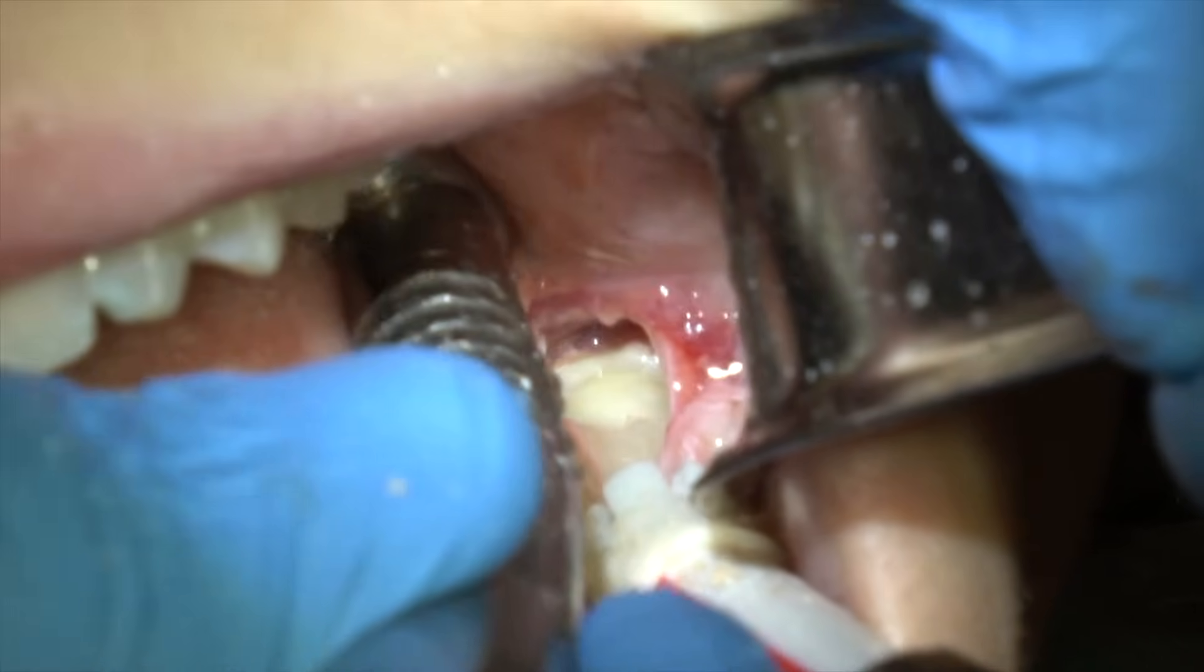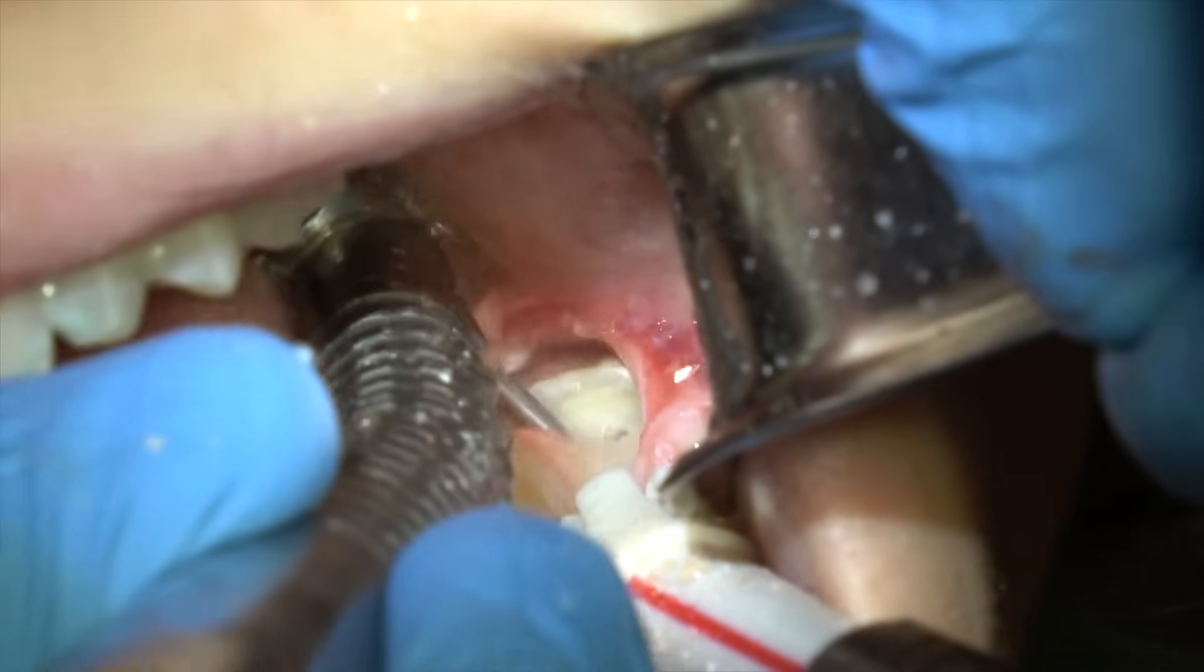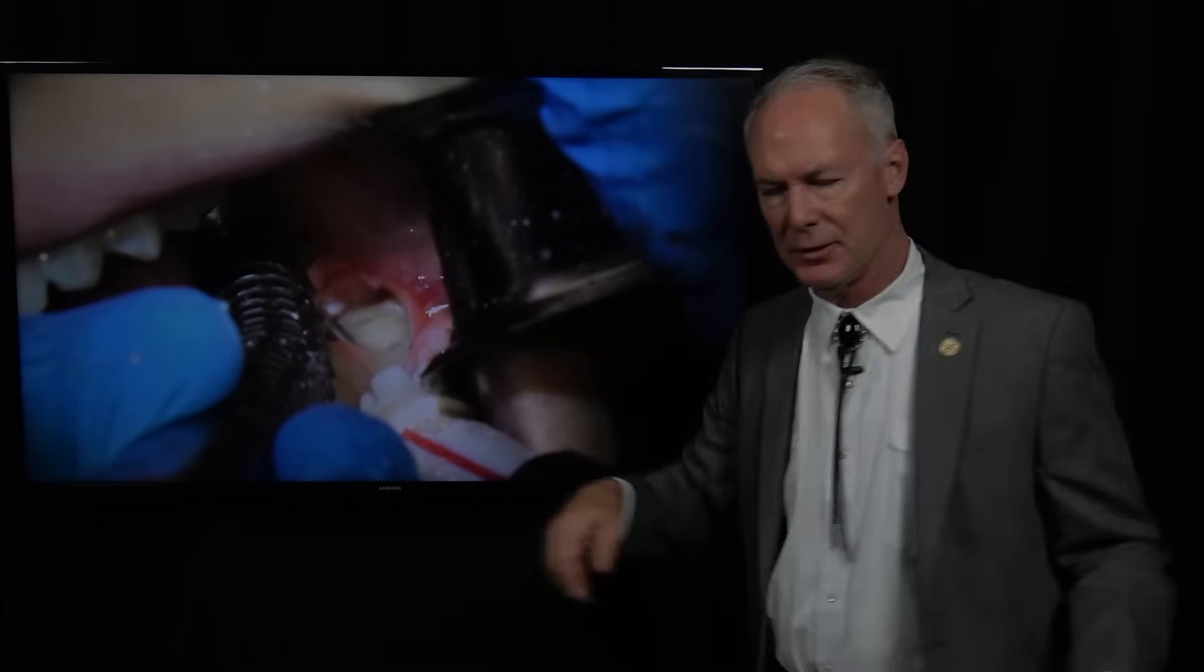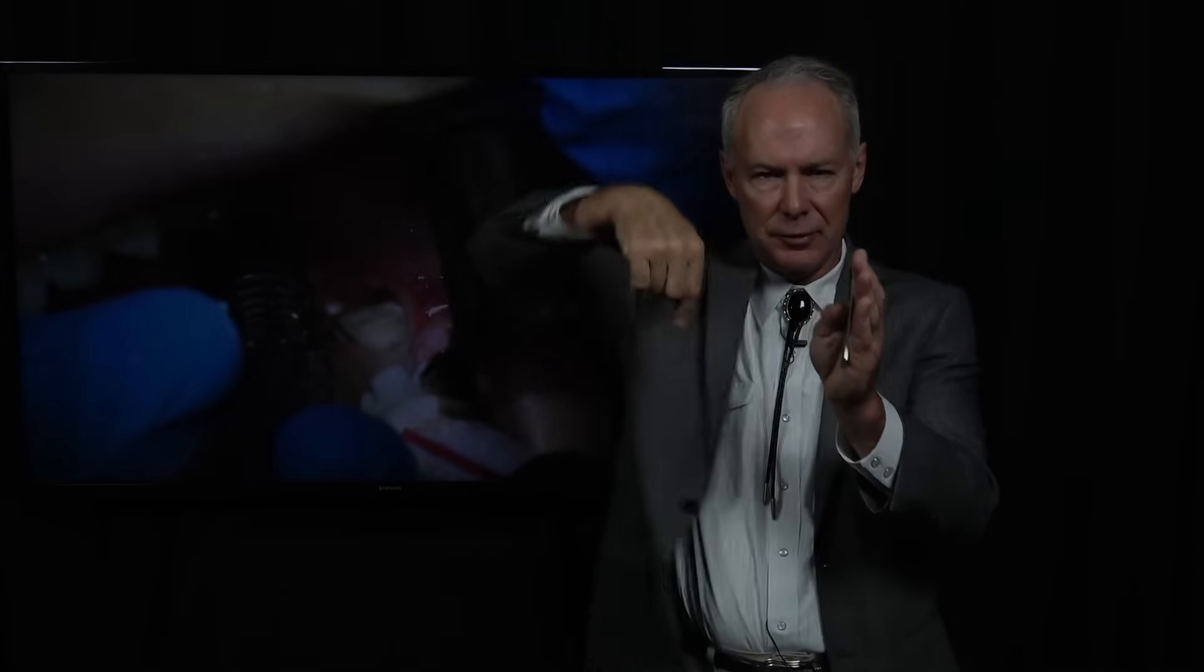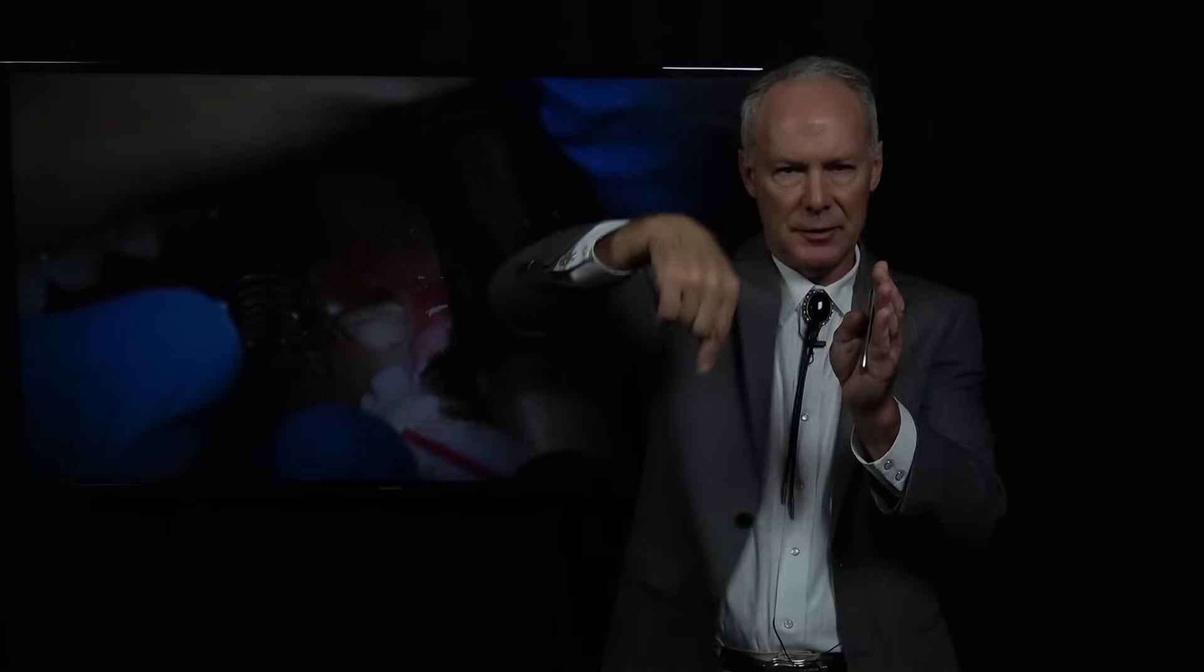And I'm going to elevate it or attempt to elevate it with this instrument. And then I'm loosening it up. Now I'm actually cutting through the mesial part of that tooth, because you'll remember how it's wedged up underneath the second molar. So I'm cutting through this part right here so I can free it up and elevate it into the space I've created. When I cut all the way through the tooth, what I'm doing is separating the two pieces.